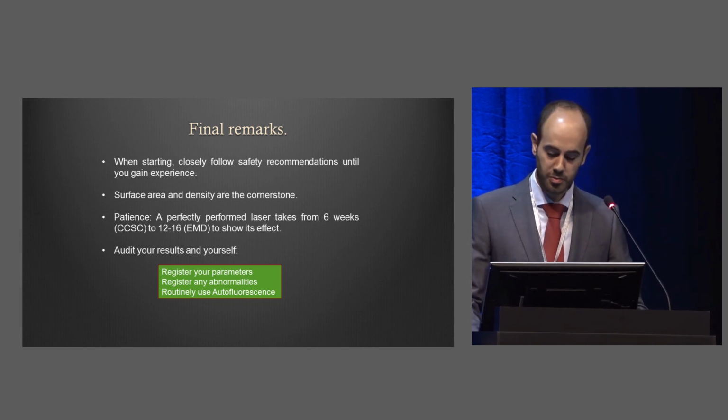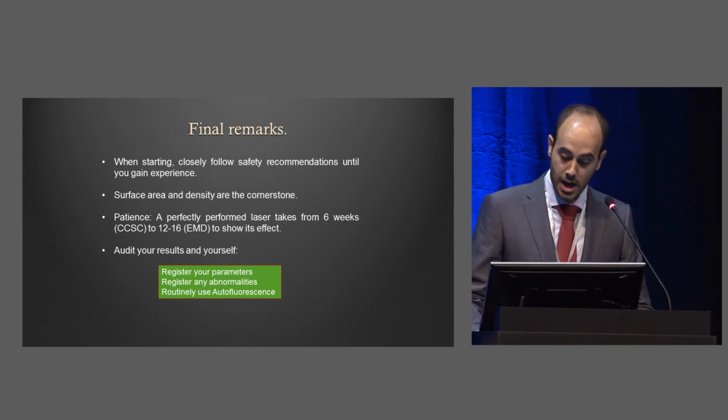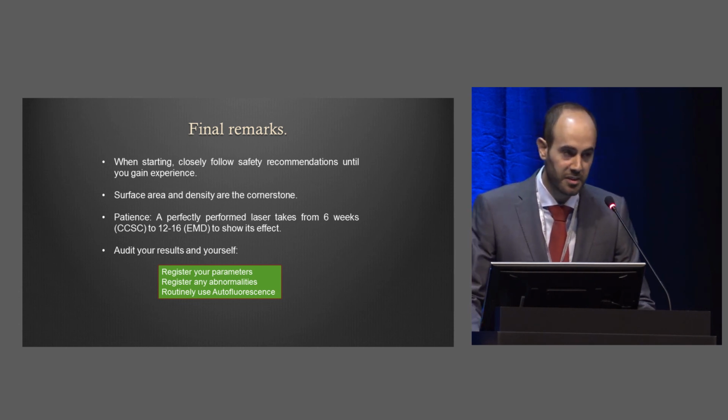In every case, register parameters, register any abnormalities you notice, so you can see if they have any influence in your outcome or not. Autofluorescence is very useful. And with this, you should be all right and having great results in no time.